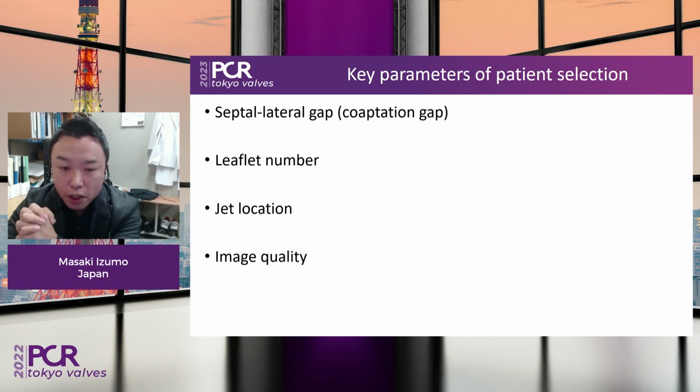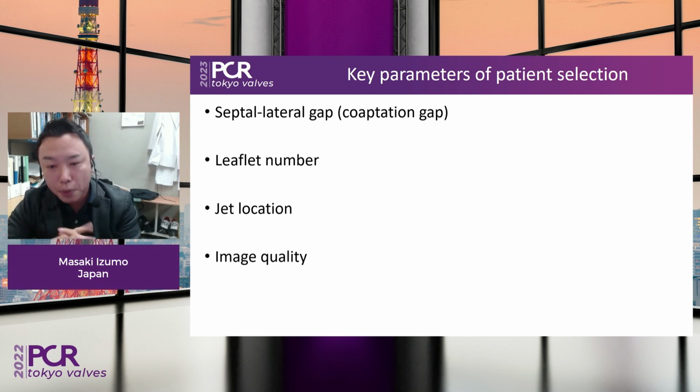In this talk, I have discussed three important aspects of patient selection, but we must not forget about the image quality of the echo. Echo images are key to the success of this procedure. Thank you very much for your attention.